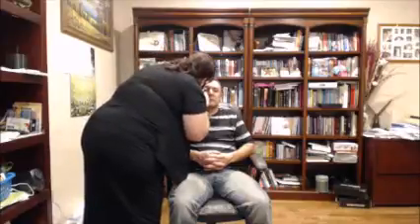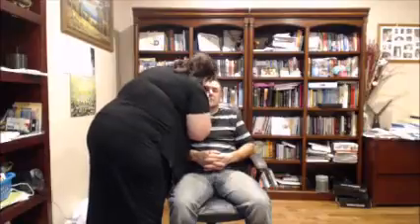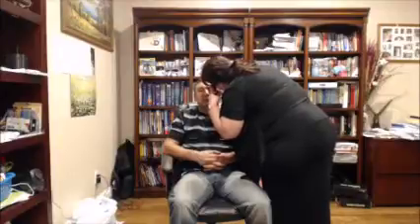Look straight ahead there, please. Try to keep your eye open. I'm going to see the red reflex and follow it into the eye. And then inspect inside. And with the left hand, my left eye. Again.